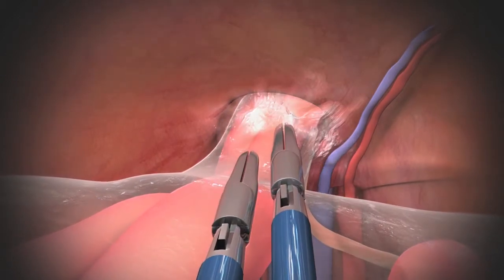So when it comes to robotic surgery, I tailor it to the patient. But we take out colon cancers with the robot, we do gallbladders at times, but mostly I use it for hernia repair. And it's more magnified, so fine work is easier to do.